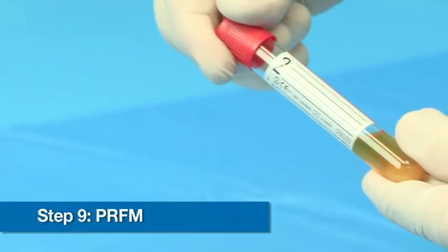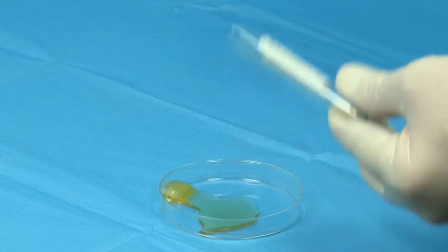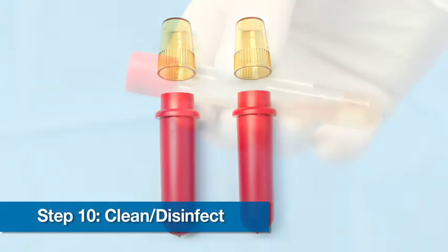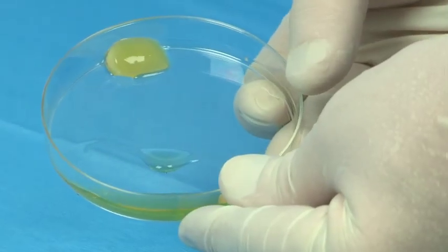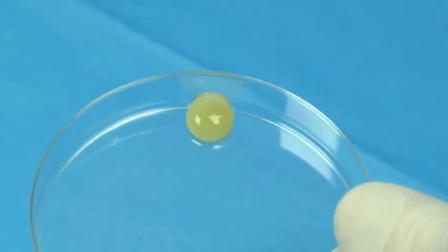Remove stoppers from red Prfm tubes and pour Prfm into sterile field. Tube holders and caps should be cleaned and disinfected after each patient's use according to manufacturer's recommendations. Dispose of all needles, tubes, alcohol swabs, and transfer device into appropriate biohazard container.